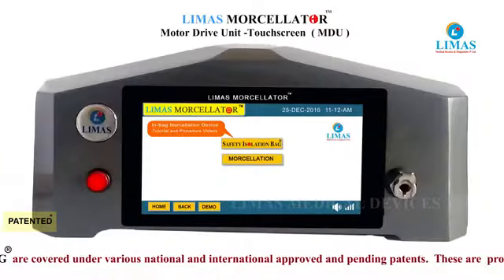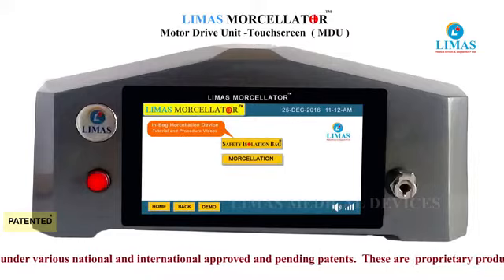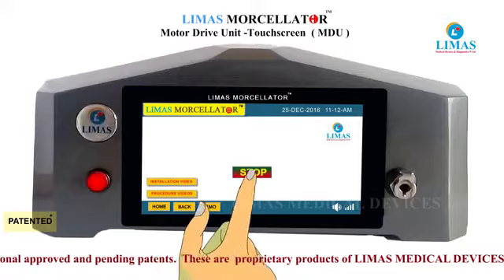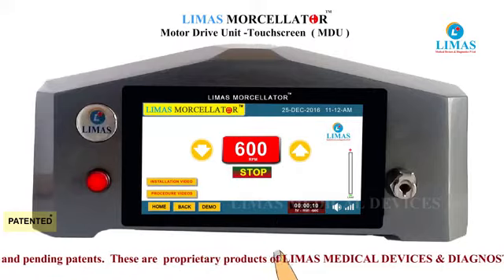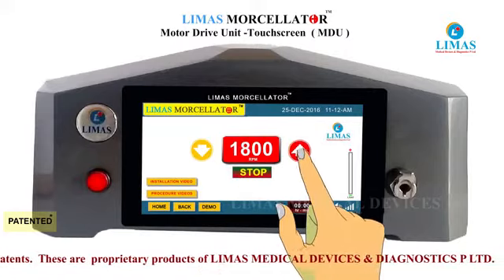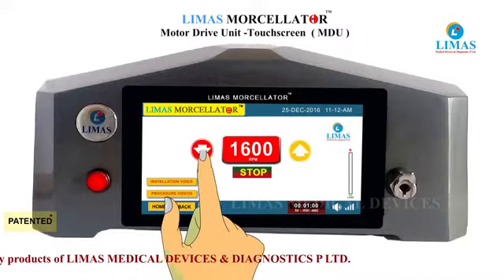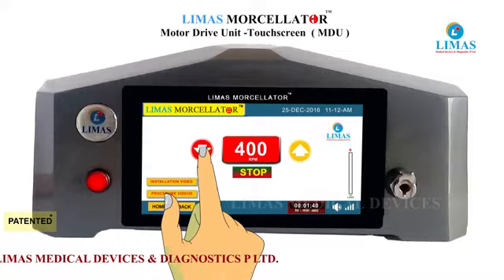The Limas Morcellator system has a touchscreen motor drive unit and an optional motor drive unit without touchscreen. The touchscreen system sets a default speed of 600 RPM and can be increased up to 3000 RPM. The speed can be brought down to as low as 50 RPM if needed.